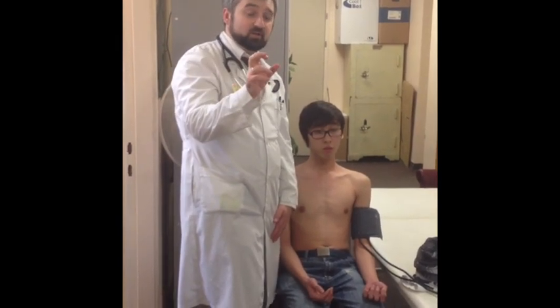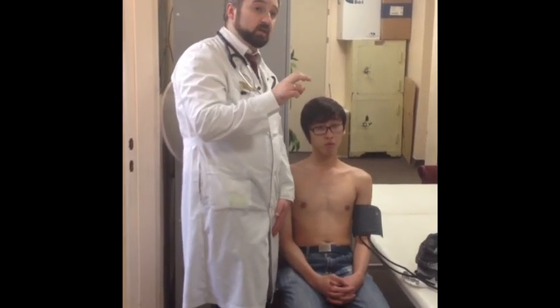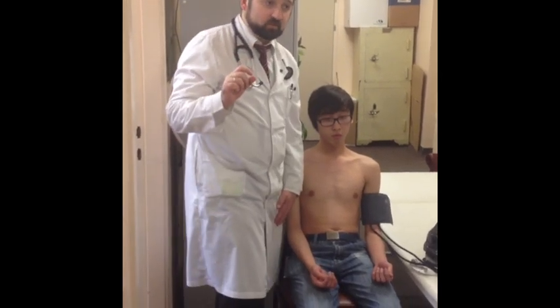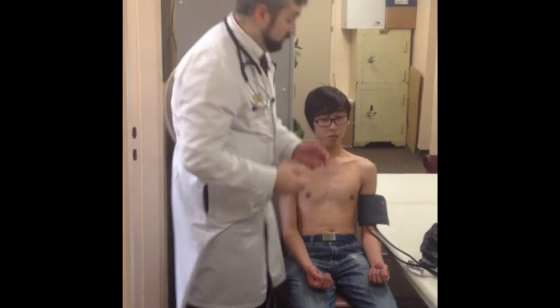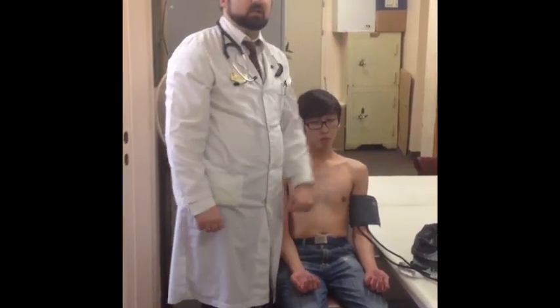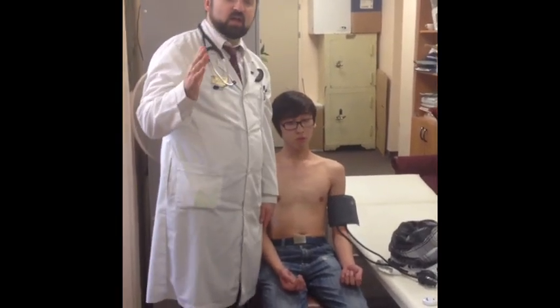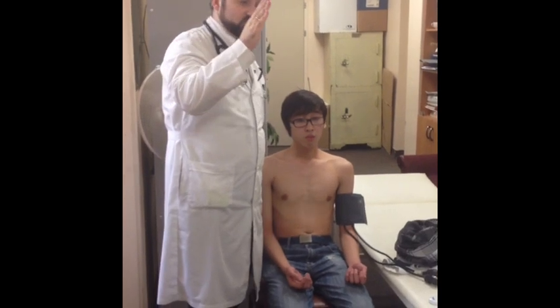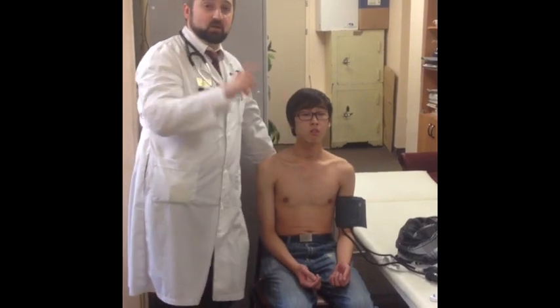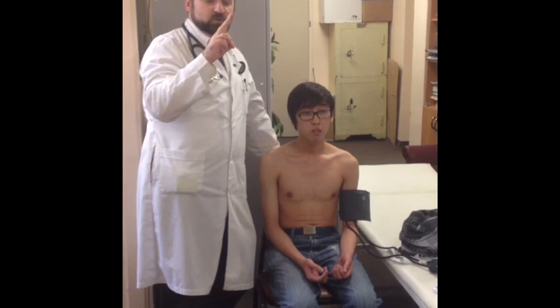Then you listen and begin to decrease the blood pressure relatively fast to find the area where the Korotkoff sounds appear and where they disappear — the area, not the exact value. In the second run, you do not palpate; you already know the highest point. You increase the pressure to, for example, 160, then decrease slowly at two millimeters per second — one click of the device per second — and wait for the first Korotkoff sound.